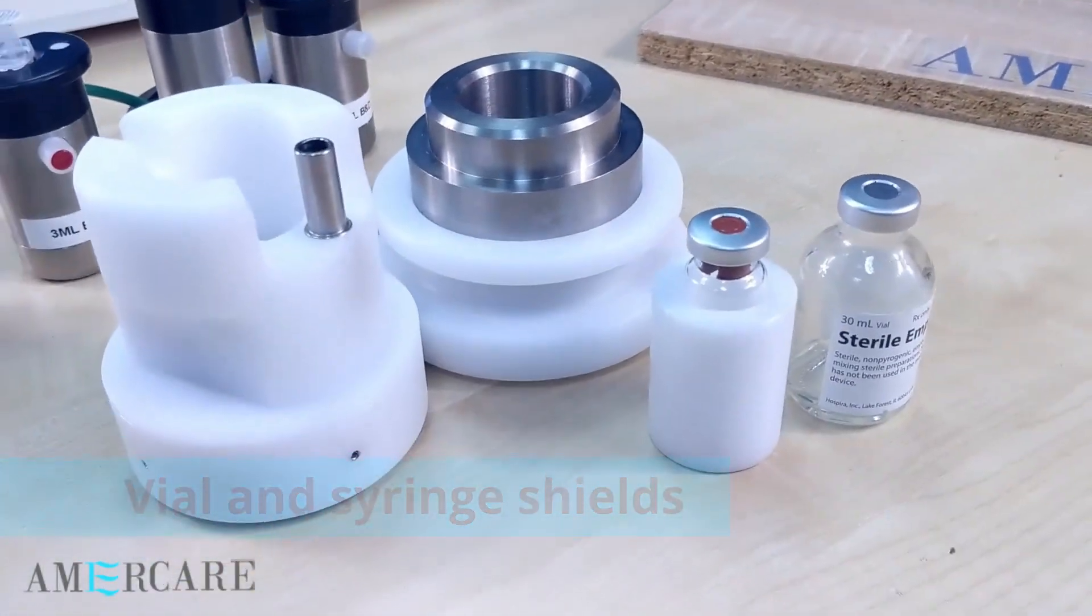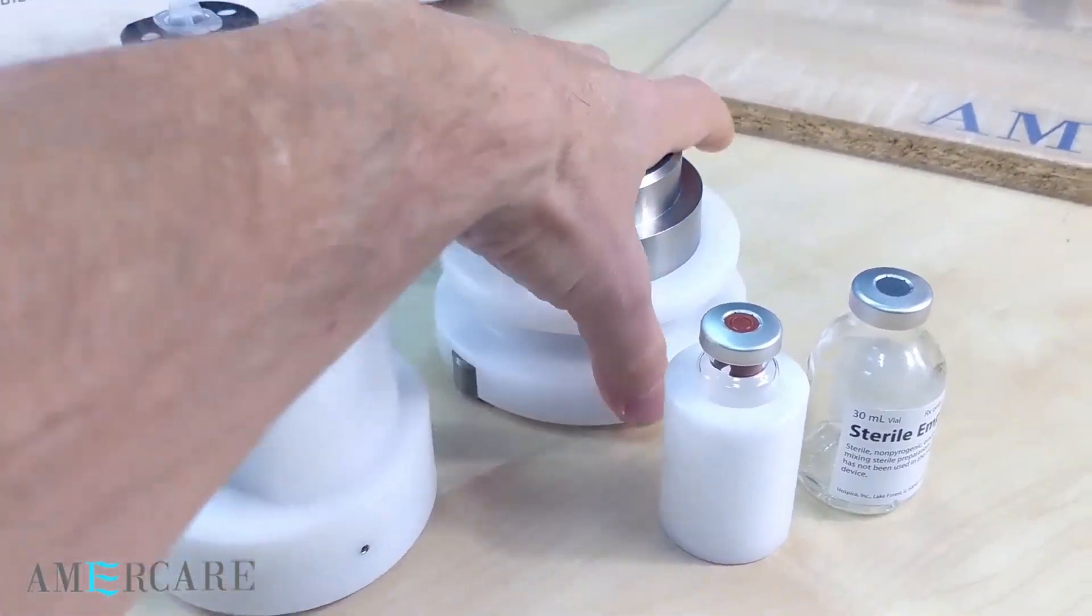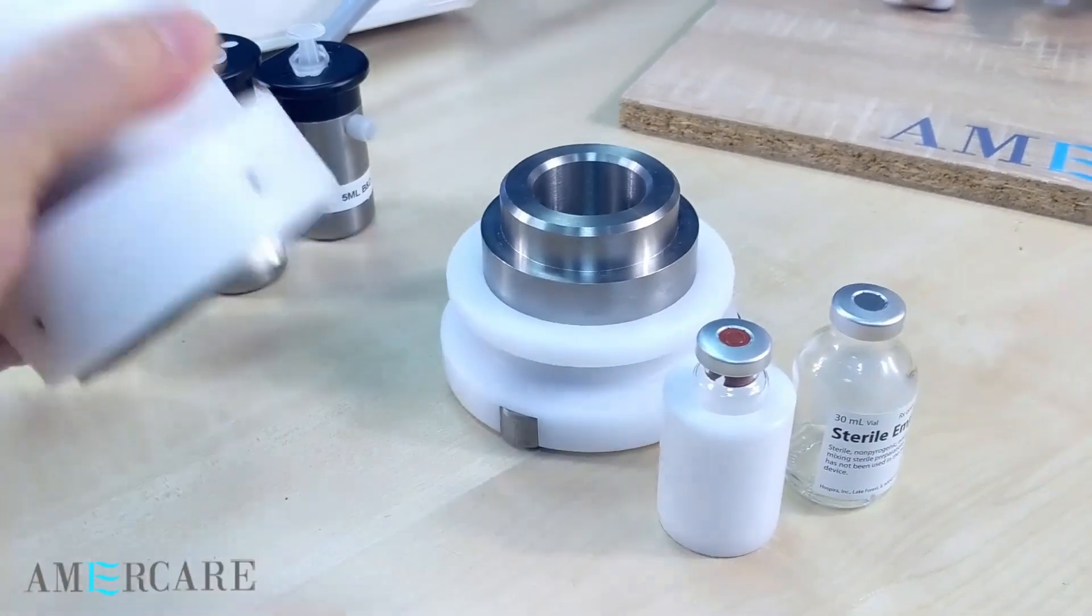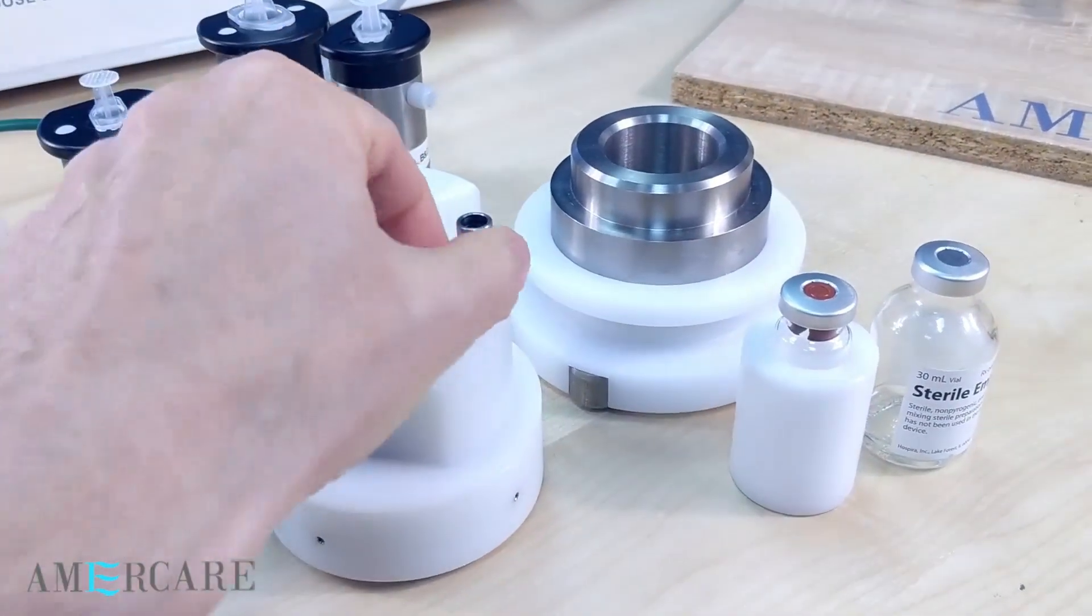The vial shield consists of two parts: the base, which has rollers on the underside to aid movement, and the lid. This is fitted with a sheath holder, which we will discuss later.